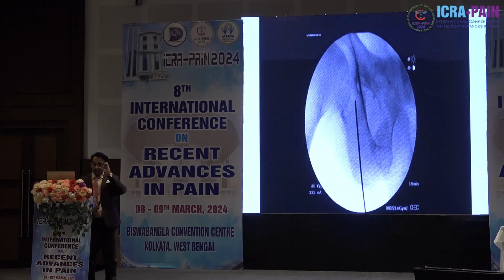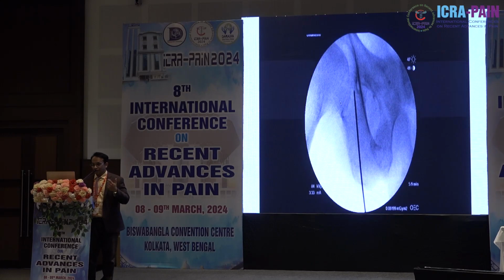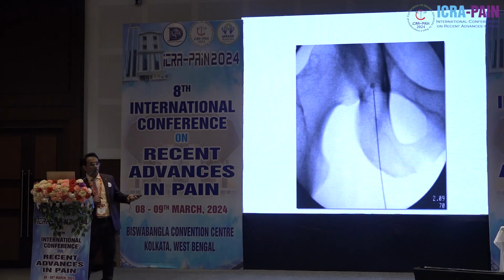The femoral vein is there and the femoral artery is there, the nerve as well, but there are high chances to injure the vasculature. So I always prefer keeping an ultrasound whenever I'm doing this, especially at this location, to avoid damaging these structures. Here you can see it has reached this particular target. One lesion we do over here, of course, definitely after the stimulation, sensory and motor, and then you can come down over here and do the second lesion.